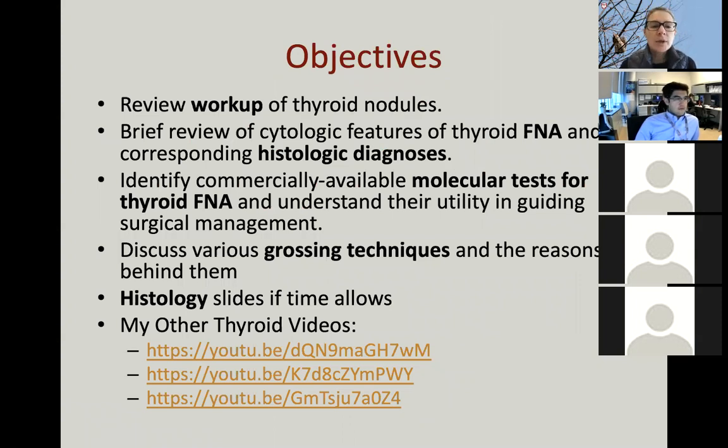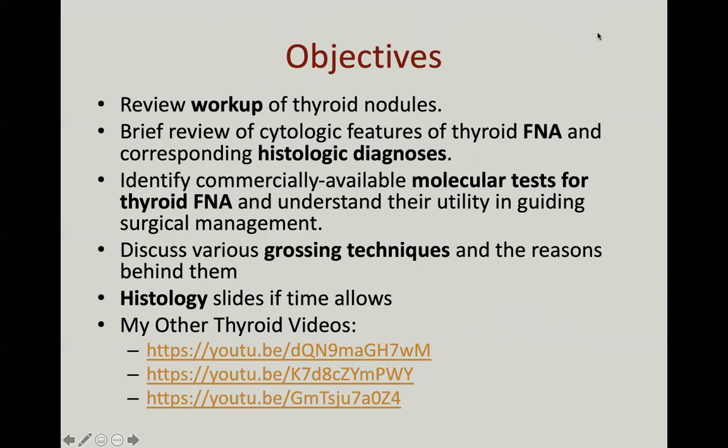All right, so we're going to review workup of thyroid nodules. We are going to briefly review some cytologic diagnoses and corresponding possible histologic diagnoses. We're going to identify commercially available molecular tests on thyroid FNA in order to understand their utility in clinical management. And then we're going to discuss various grossing techniques based on the cytologic or FNA diagnosis and the reasons behind them. If time allows, at the end of today, we'll do some histology slides. And just as a reminder, my other thyroid videos on my YouTube channel are linked there.